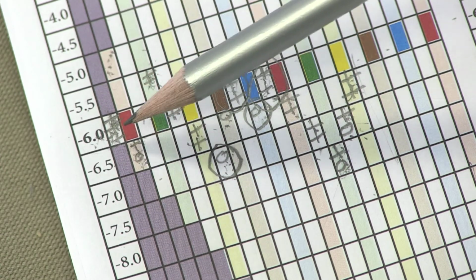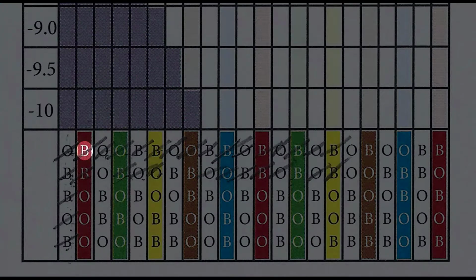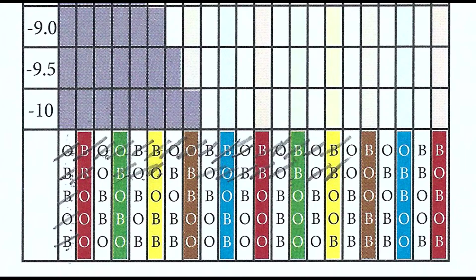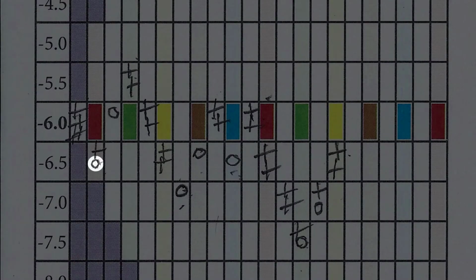So the next trial, at that next lower concentration, we gave a blank and the odor. He indicated that it was the second one that was strongest. He was correct, so we put a plus in here. Then we presented the blank and the odorant. He said the first was correct and he was wrong. So we put a 0 in here.